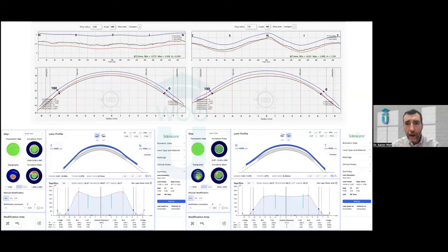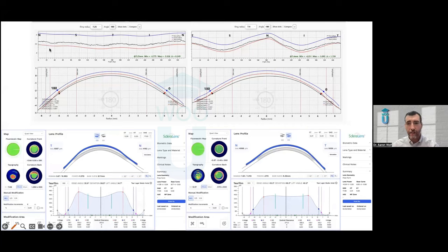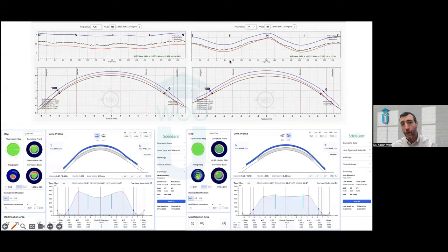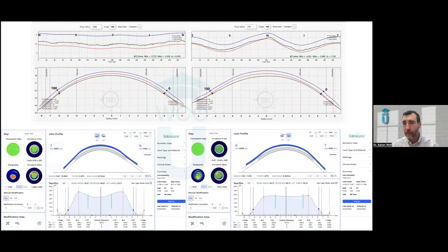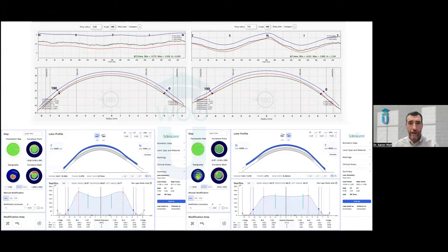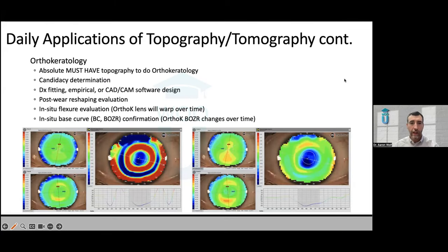The external software also allows you to tackle cases that would largely otherwise be impossible. For instance, one particular patient had about 1,000 microns of elevation change at the edge of a 16-millimeter lens — it would have been impossible to fit without this software. You can literally design the lenses, visualize them, and change them to your own personal preferences. As you get deeper into contact lens fitting, you develop your own philosophies on contact lens design.